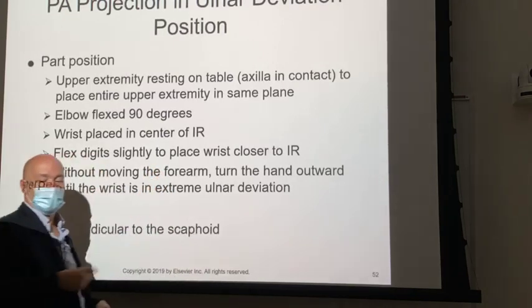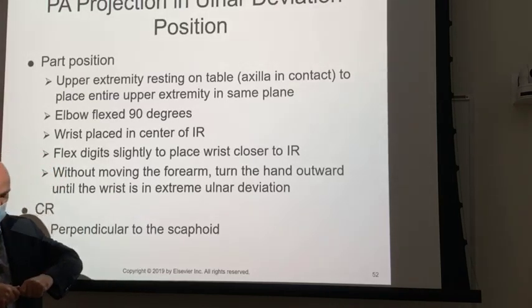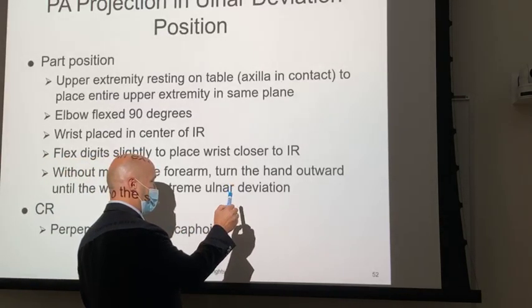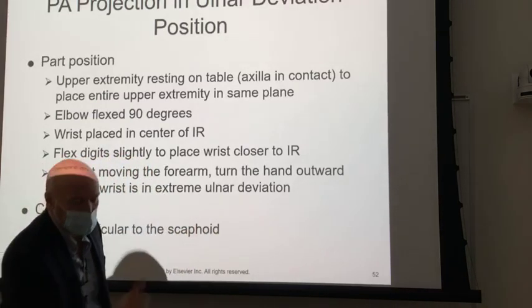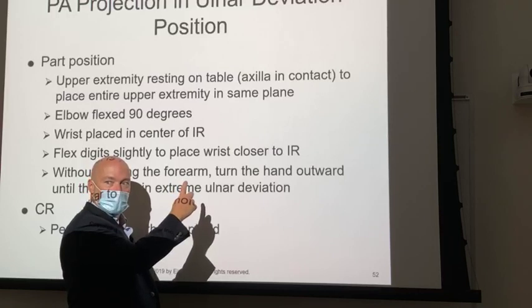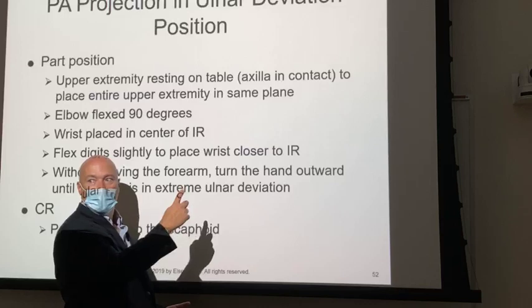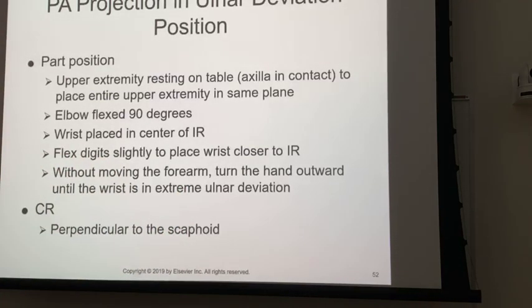The problem is that fractures, much like joint spaces, if the central ray isn't parallel to the fracture, we're back to this. You know, we've got good joint spaces and we've got no joint spaces. So if the fracture in the scaphoid is down here, then it'd be kind of like trying to see this joint space with that finger bent. Would you be able to see it very well? No, you wouldn't. So the ulnar deviation and the Stecher method both seek to try to eliminate that.